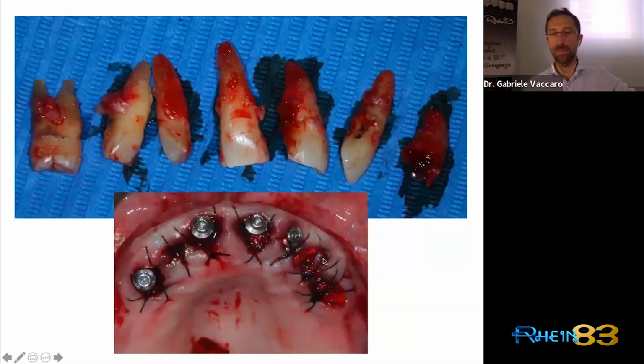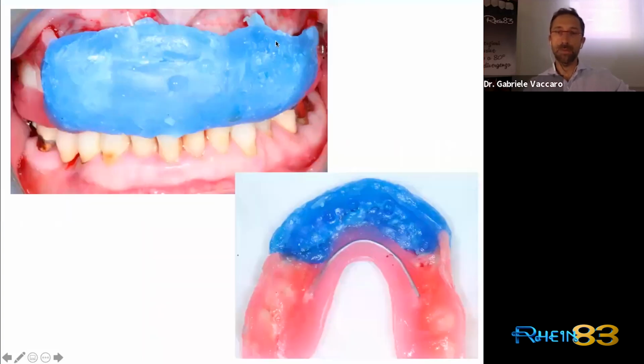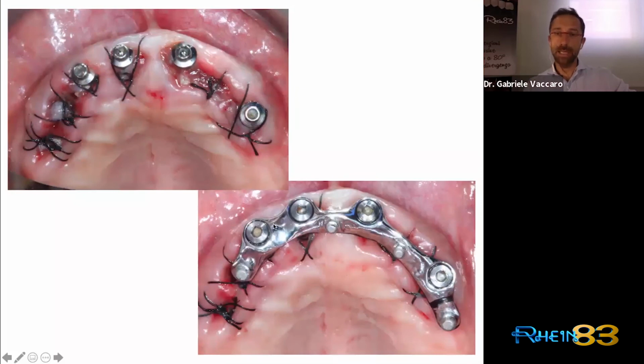After that, a short slide of the implant procedure. So we put the implant. This was the implant site where the root was saved with the pivot, and this is the tooth with the clamp that is no more useful for the implant. And in fact, in this part, the last implant that we could put was this on the lateral incisor. We took the impression, and then we made an immediate load.